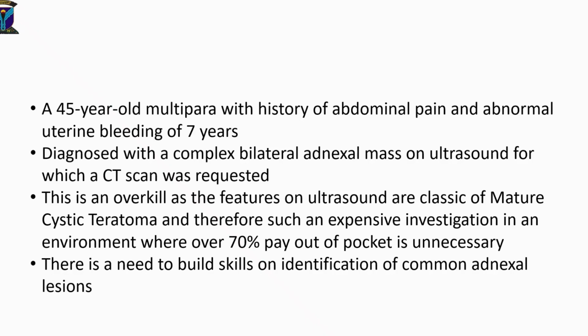To me, this was an overkill to request for a CT scan when the ultrasound morphology was classic of mature cystic teratoma. In Nigeria, over 70% of patients pay out of pocket. This woman is a full-time housewife. Her husband is a retiree. So one can imagine the financial burden imposed on this family because of the label of an adnexal lesion as complex.